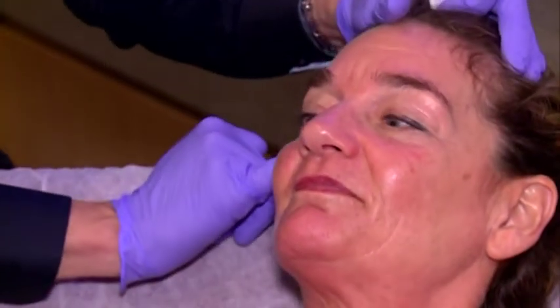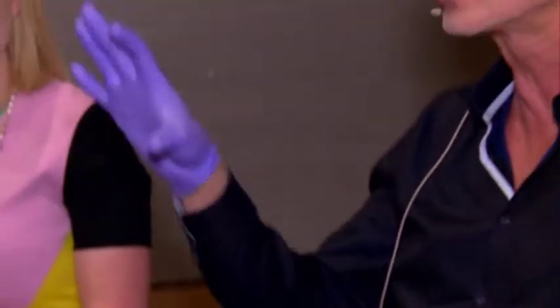The thing is, if I went back like here, this was more problematic, or was it more discomfort? Yeah. So this is a very, very fibrotic area in the hairline here. So when you're injecting here, you need a little bit of power. And you cannot do this with a 27G cannula, because a 27G cannula is as sharp as a 27G needle. So you have no advantages. This has been proven also in a new study. And the other thing is, this bends and turns away, and you're not precise at all. So that's why I really prefer a stiff cannula.